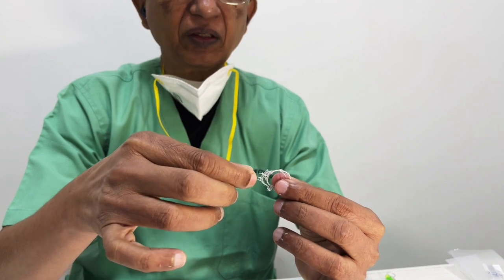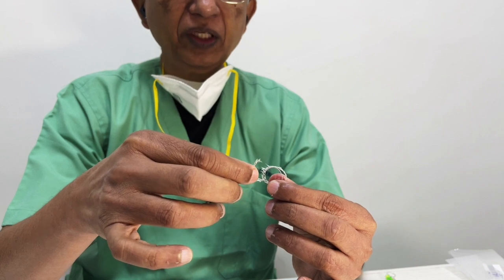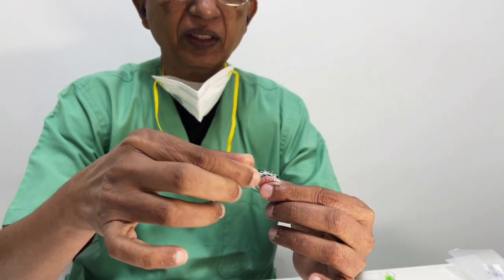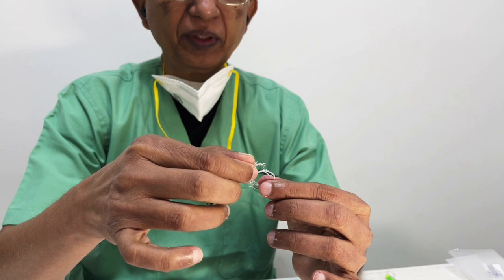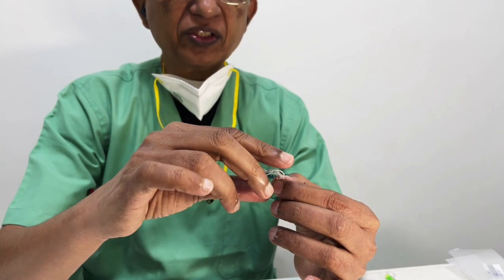So Nestor is a Cook's coil, and other companies make coils the same way. Predominantly today, there are only two companies, Boston Scientific and Cook, that give us these kinds of coils. So these are fibered coils. You can see the fiber. These are pushable coils and not detachable coils, made of platinum, but they're not very soft.